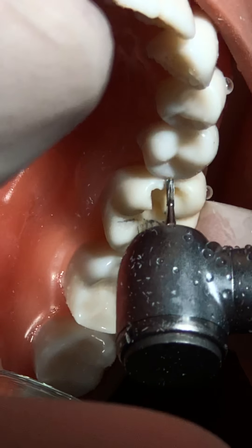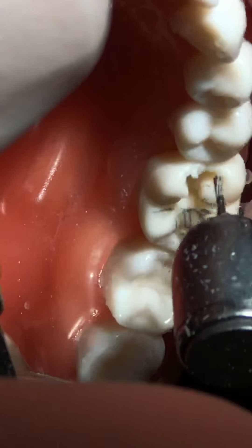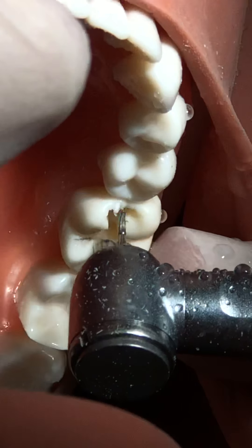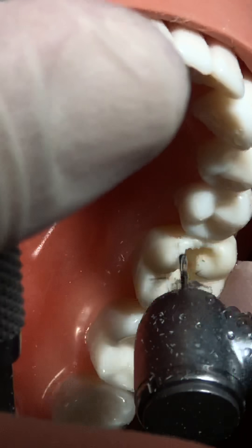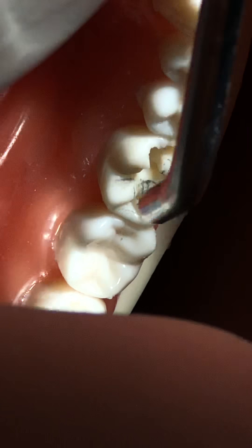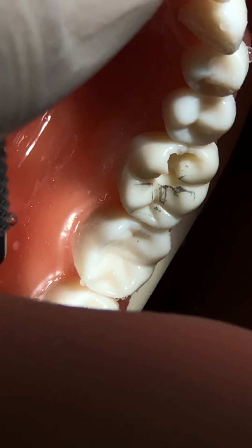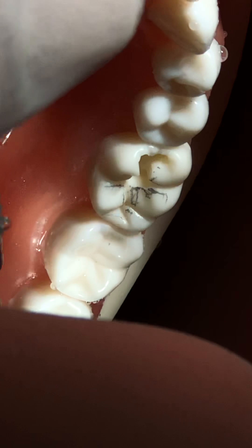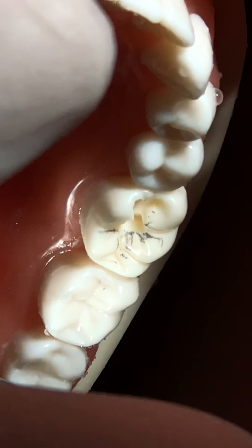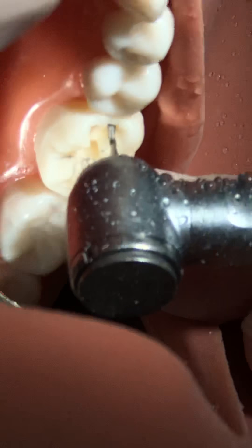The contact point is slightly towards the buccal, less towards the lingual and more towards the facial. I'll follow this until I reach a very thin portion of enamel remaining. In the natural tooth, enamel is very brittle - if you remove the dentine below the enamel, the enamel will flick away. In a plastic tooth it's harder, but I'll show you so you can remember when doing it on a natural tooth. Check all depths - every depth is okay.